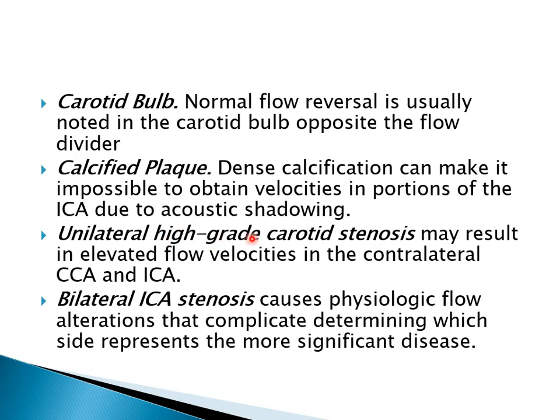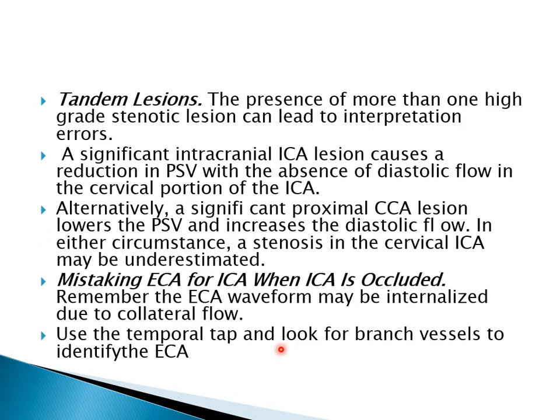Sometimes unilateral high-grade stenosis may result in elevated flow velocity in the contralateral common carotid and internal carotid. Bilateral stenosis causes physiological flow alteration that may complicate determining which side presents the more significant disease. Tandem lesions, the presence of more than one high-grade stenotic lesion, can lead to interpretation errors.